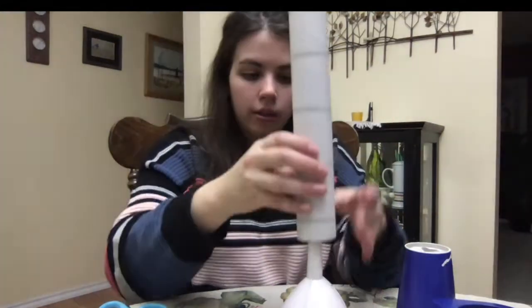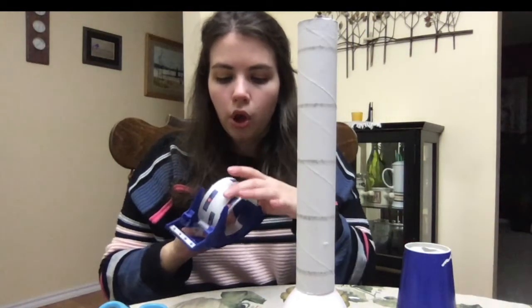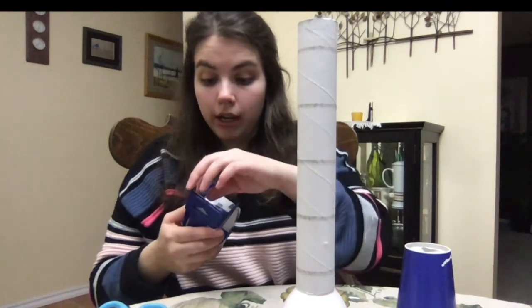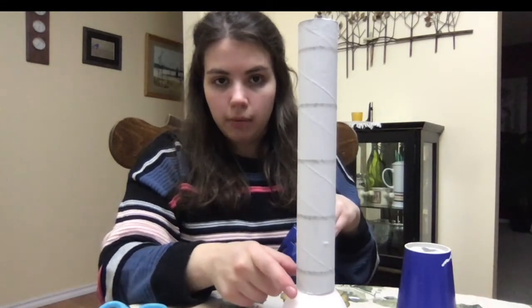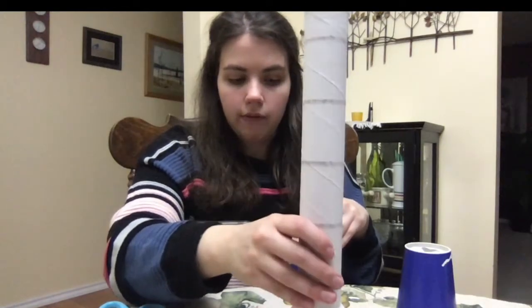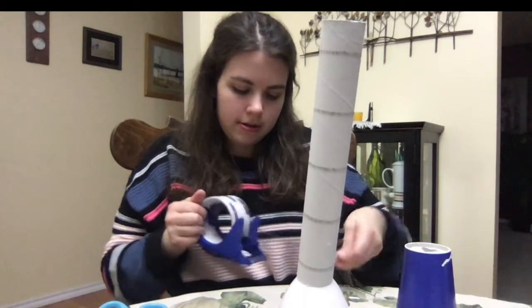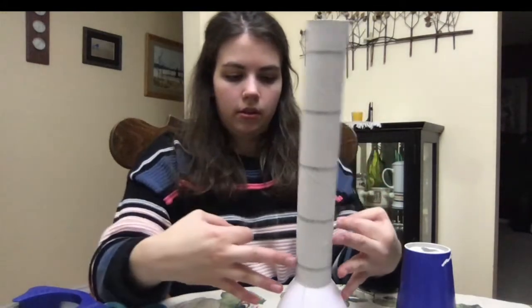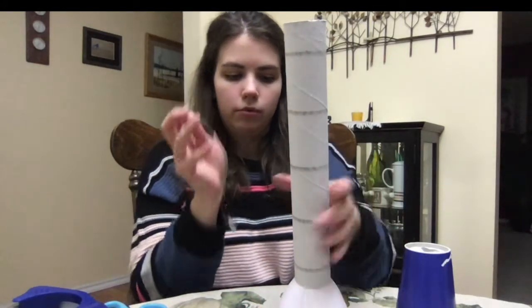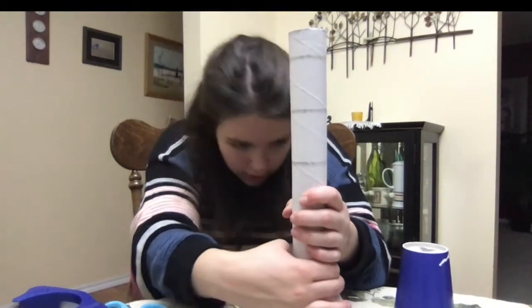Now we're going to take our paper towel roll. I flip my funnel upside down. I'm going to stick it on there like that. And we're going to take our tape. So probably a thicker tape is going to work well rather than just a skinny masking tape, because we're just going to tape this paper tube or whatever you have to our funnel. So I'm going to rip some here. And let's try. I'm going to try and keep my tube up and down and stick this on somewhere in the middle.